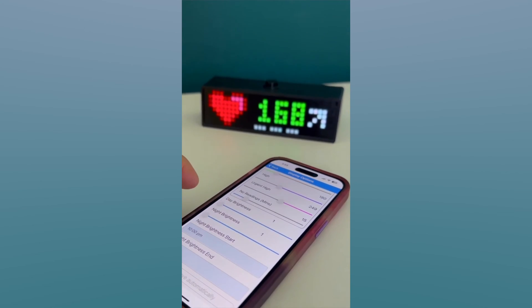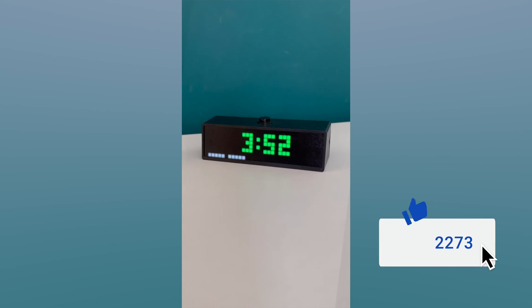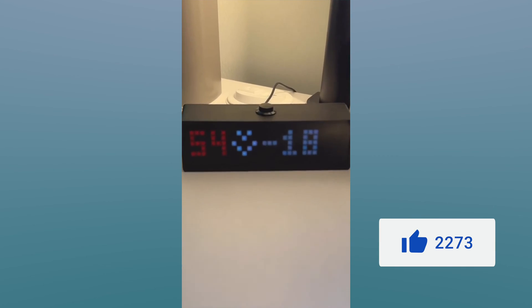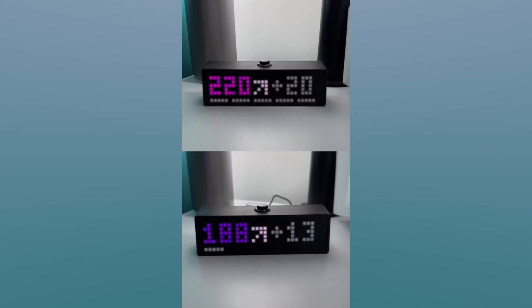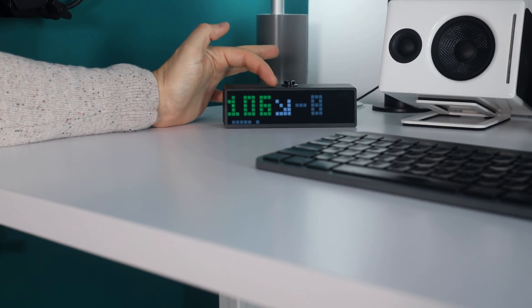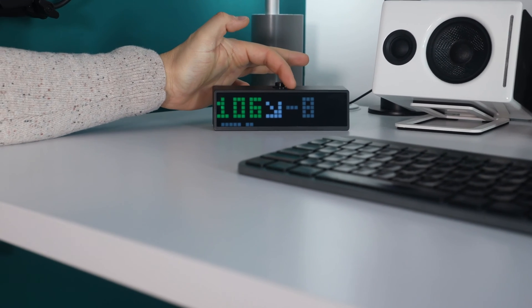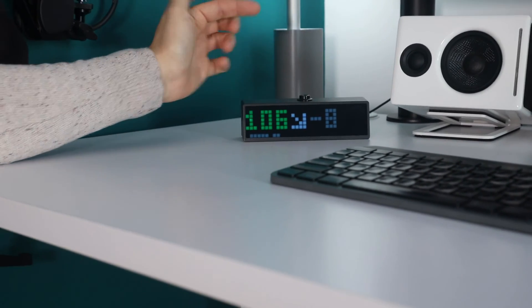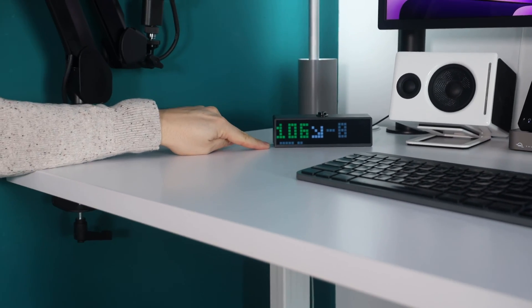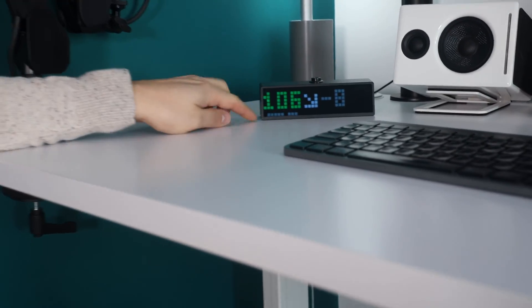The number on the screen changes colors based off of the ranges that you've set. It would be red if I was low, yellow if I was a little higher than that, and it goes all the way up to pink if I'm super high. Then I've got an arrow showing that I'm slowly dropping, and this over here is called the Delta — I went down eight points from my last reading. At the bottom, there are lines signifying the five minutes between getting Dexcom readings.